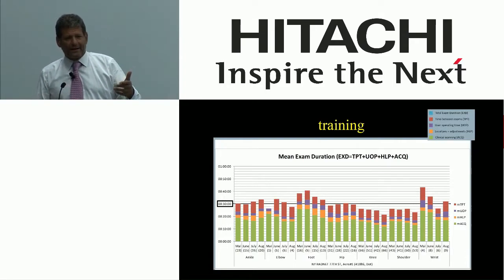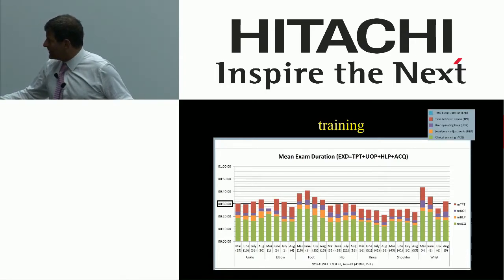So I looked at the green part of the exam, by the way. Look at the green. It's not any worse on those exams. Look at the green on the foot and ankle. It's not terrible, particularly after we optimized. Look at that. We went from there to there. You can see there's an impact, but still we're struggling.